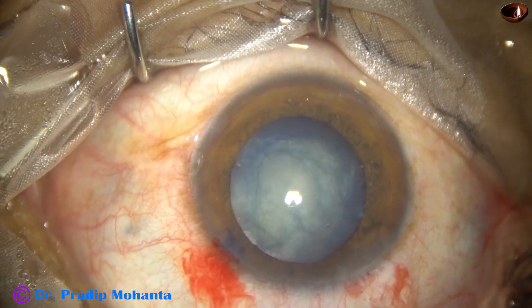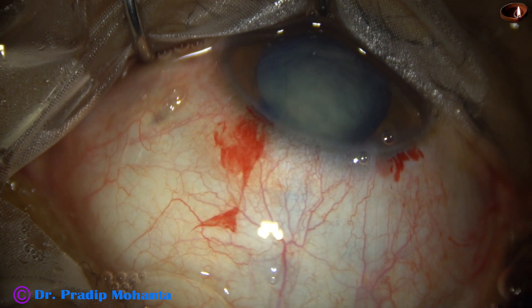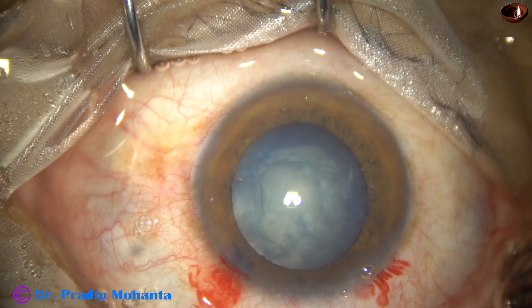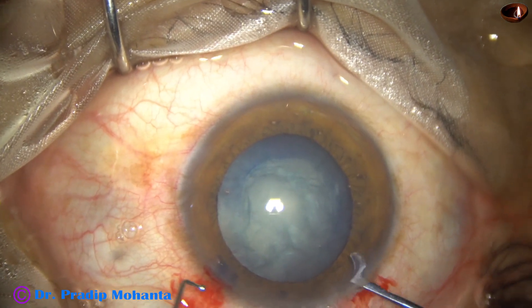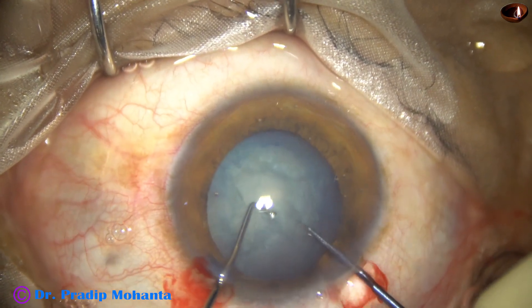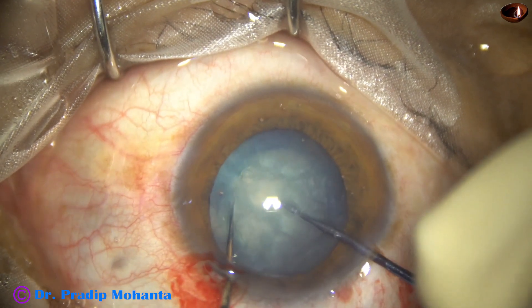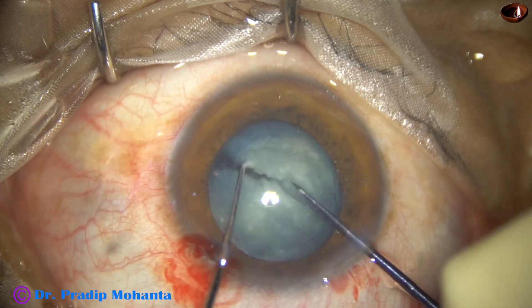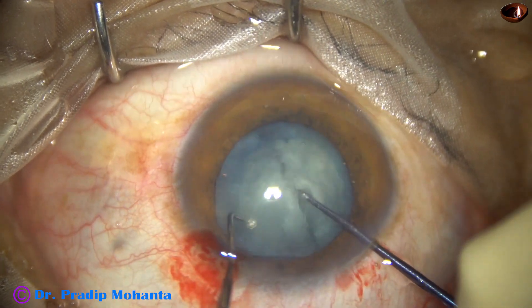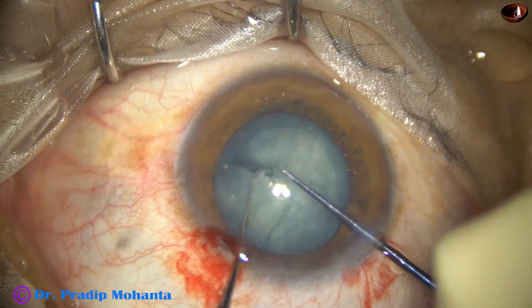Now I inject visco. In this case I am going to divide the nucleus using a pre-chopper — this is Dr. Suhail Irfan Khan's pre-chopper. The lens is divided into two pieces first, then I rotate, and the hemi-nucleus has been divided into another two pieces.